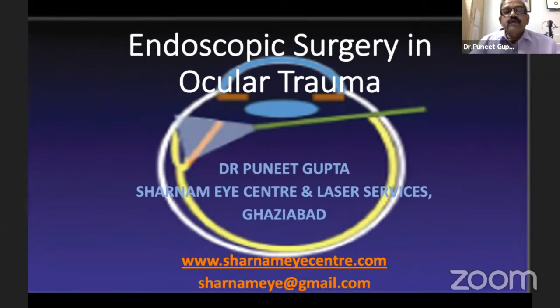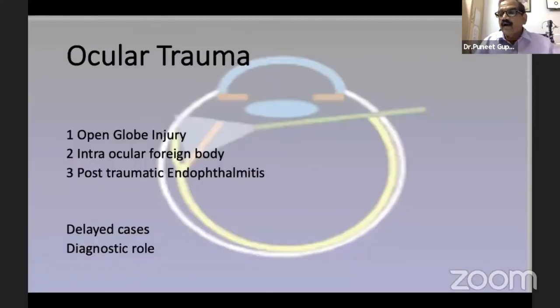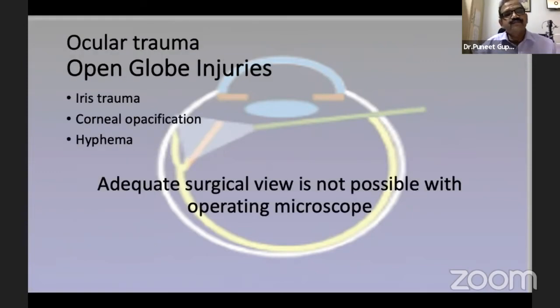Thank you, Rajiv, for giving me this opportunity to speak on endoscopic surgery in patients with ocular trauma. I'll be talking about 3 scenarios, that is open globe injury, intraocular foreign body, post-traumatic endophthalmitis, and also be touching about delayed cases and the diagnostic role of endoscopy in patients with ocular trauma.